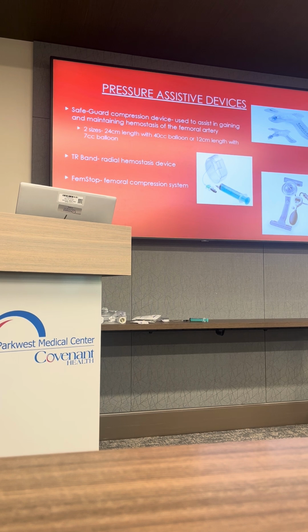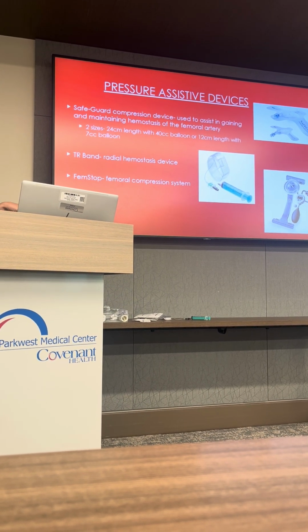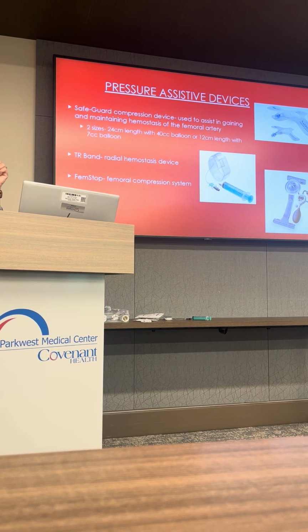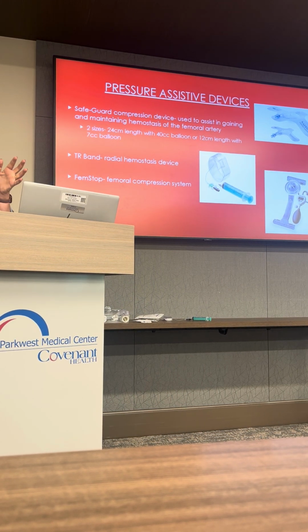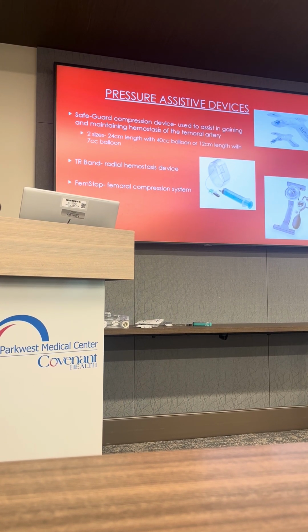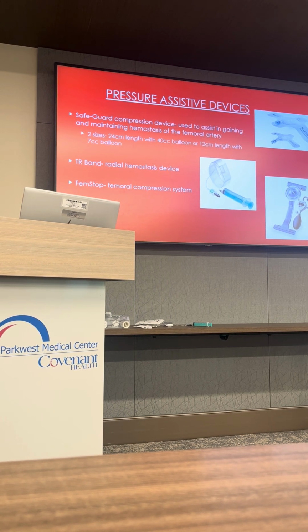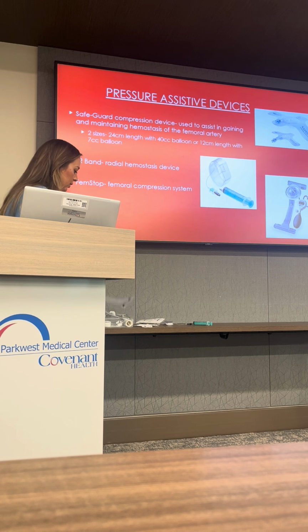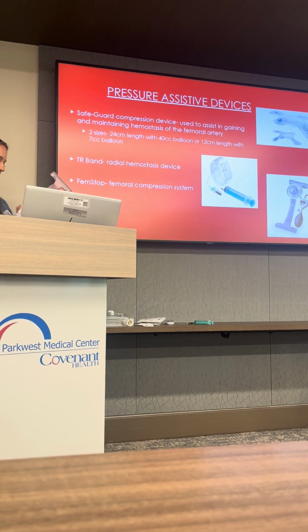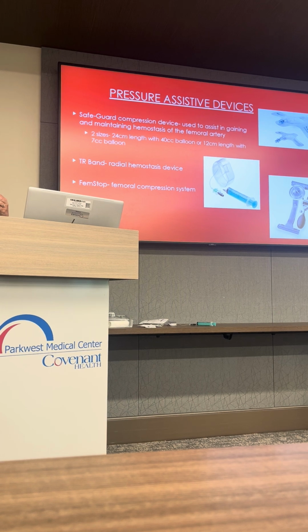Especially with the FemStop, I was actually looking over some things last night online, and FemStop is like the gold standard for femoral pressure, but there's been a lot of times where we've seen patients have gnarly bruising from having these in place. There's been limb ischemia and different things like that because we're not using it efficiently. So with this device in particular, it comes in a few different pieces. There's the gauze that goes around their body. It's connected through this clip.